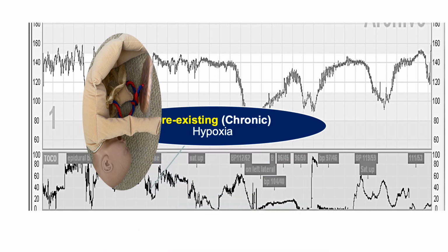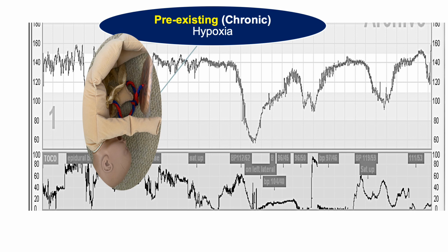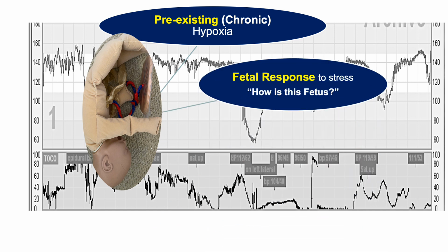Firstly, we need to ask ourselves, is this fetus fit to undertake the journey of labor? So we need to exclude pre-existing or chronic hypoxia at the onset of recording. Secondly, we need to find out whether this fetus is responding well to the ongoing uterine contractions.